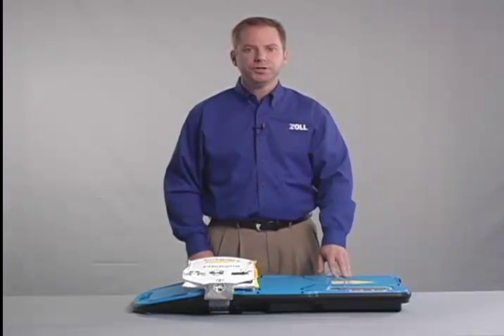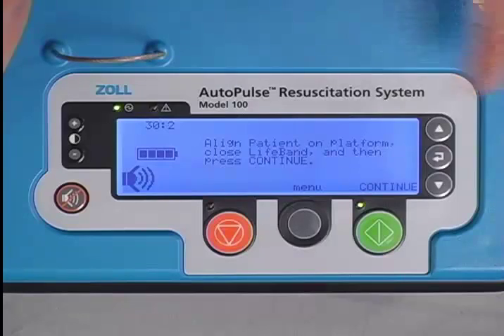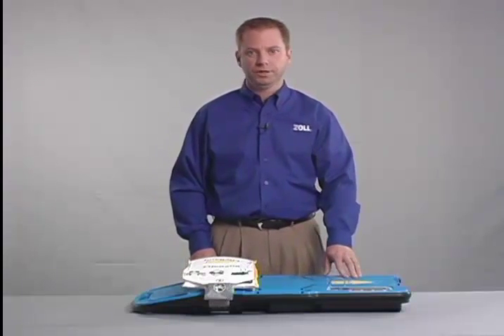The current compression mode is shown on the upper left-hand corner of the user display. In this case, the Autopulse is set for a compression to ventilation ratio of 30 to 2, in keeping with current guidelines.